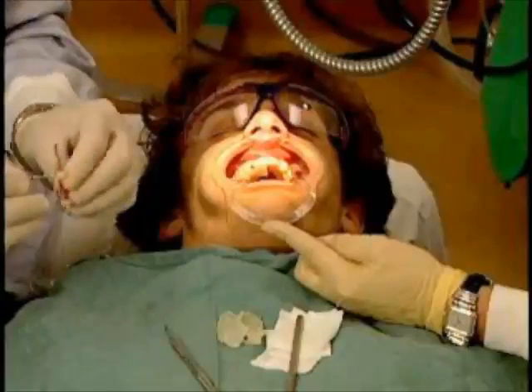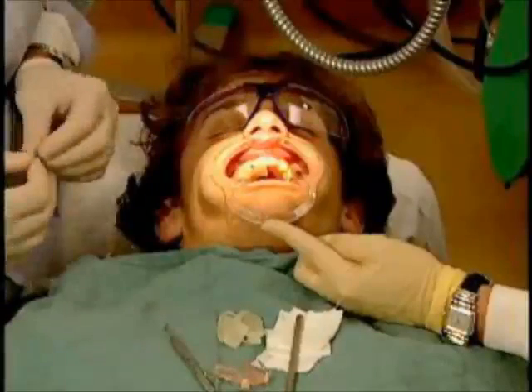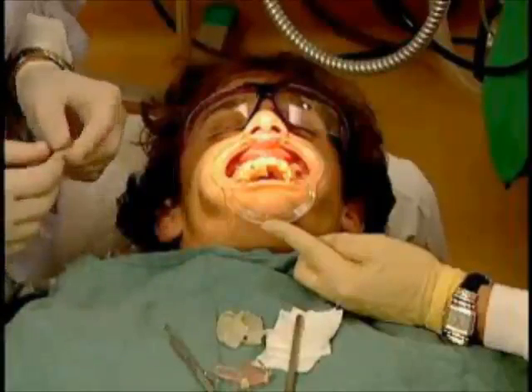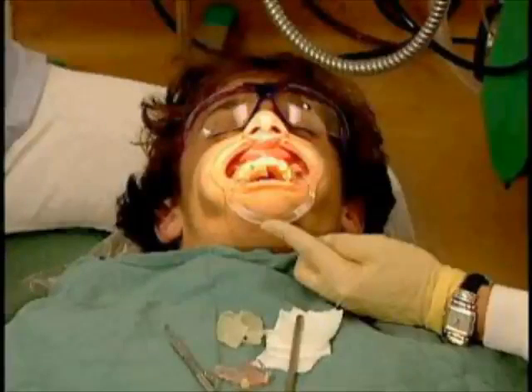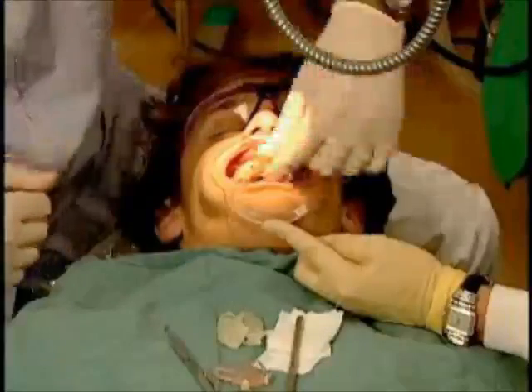So we've had the opportunity of doing that, and certainly that gives us the information we need, and we'll then coordinate that according to where we're going to place the future implants. All of this has been guided through 3D technology utilizing iCAT and SimPlant software.